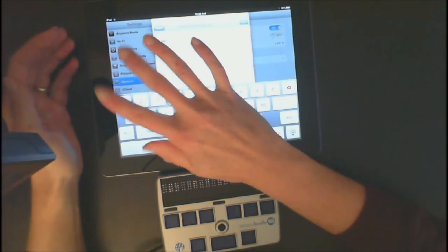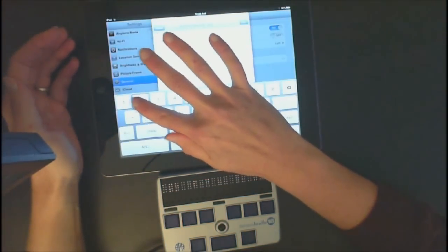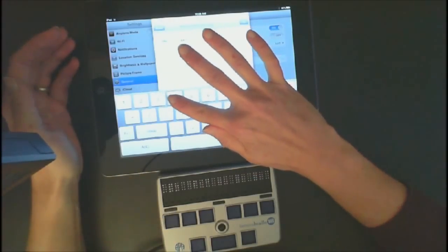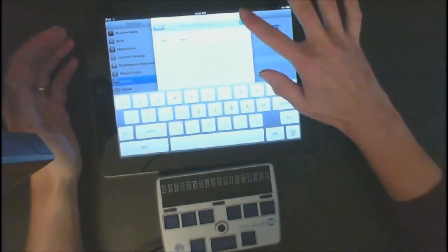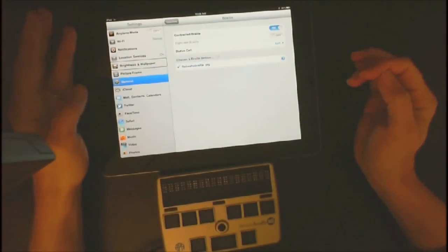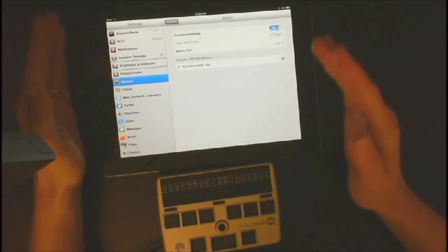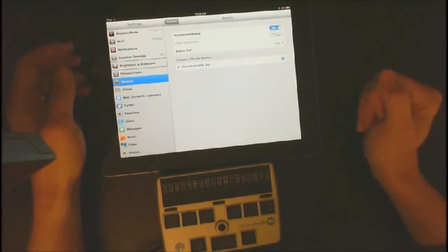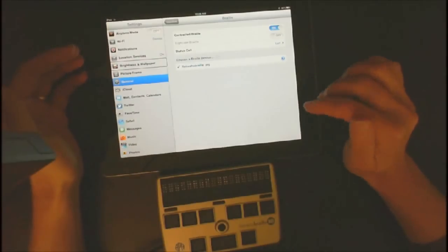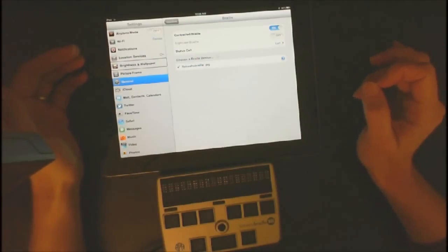Now I'm going to need to enter the code. 1, 2, 3, 4 is the code. So I'm going to touch 1 and double-touch, touch 2 and double-touch, touch 3 and double-touch, touch 4 and double-touch. Then I'm going to hit Pair. You need to do that fairly quickly, as it will lose the connection and say it did not connect. So if it did not connect, go back in and enter the code 1, 2, 3, 4 a little bit more quickly.